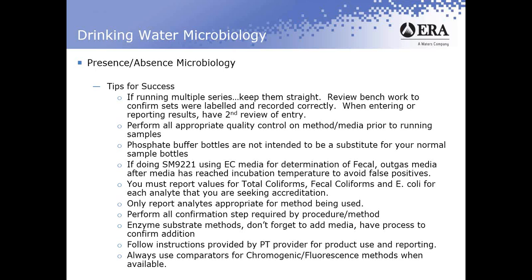Whatever you're used to reading results in, you'd want to make sure that you're using something the same. The buffer bottles are kind of opaque. It can be hard telling if you're getting the chromogenic or fluorogenic change.